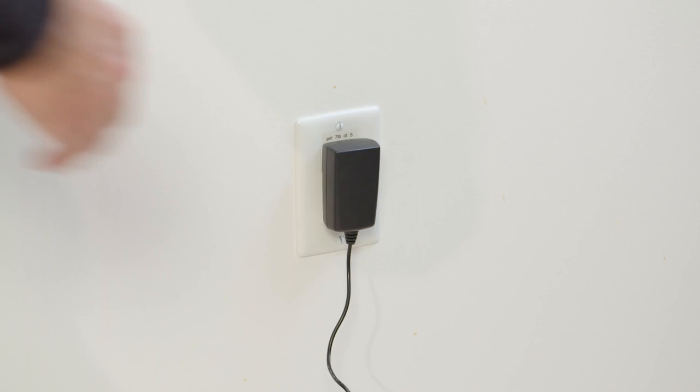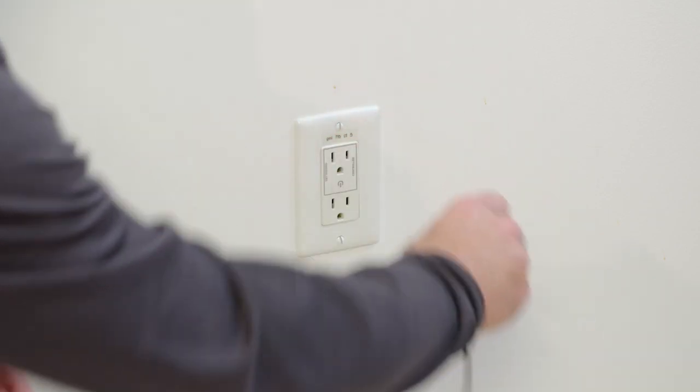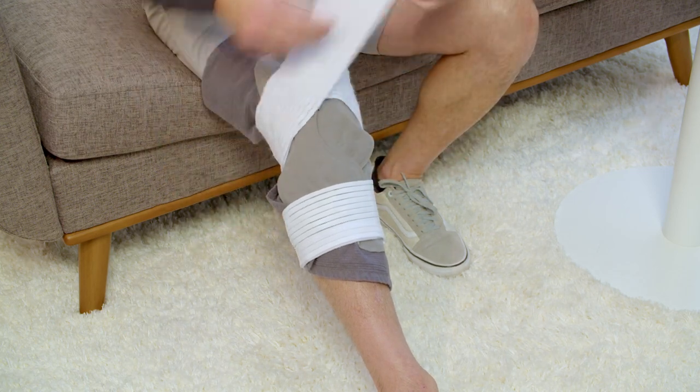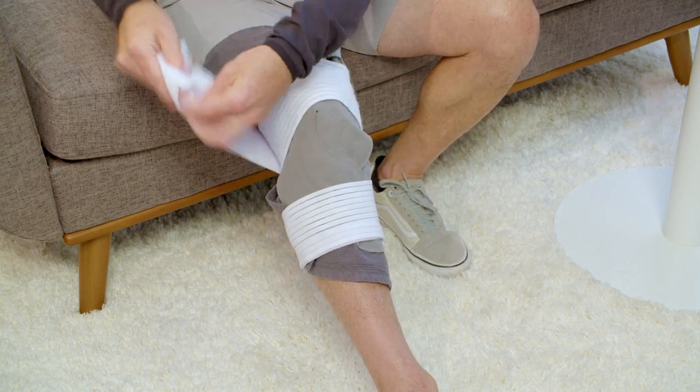To turn off the cold therapy device, unplug the power supply unit from the wall socket. Always turn the cold therapy device off before disconnecting the Cold Rush pad or any hoses.